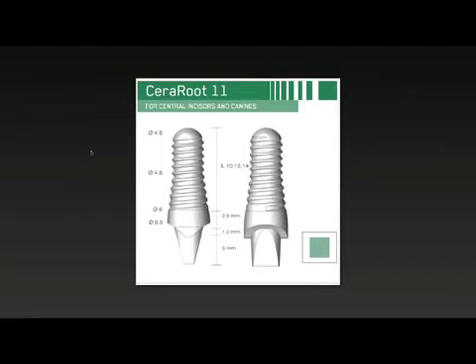We are not too worried in the front with something that's very wide, because again, we don't have the connection. With titanium, that connection is a problem when we have to build in the profile, we have to add abutments. When we don't have a connection, the leeway of what we can do with these implants is much greater.